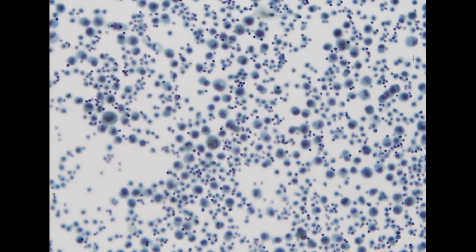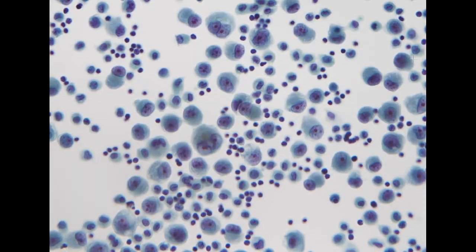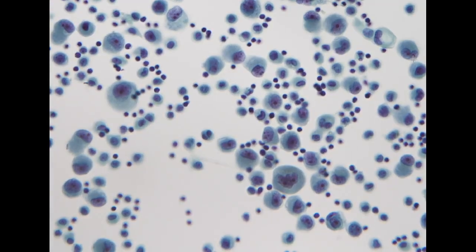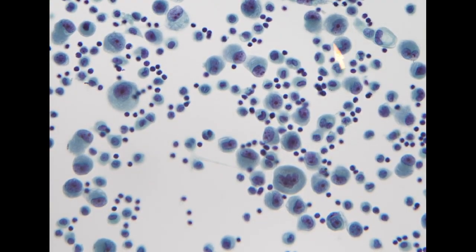So back to the pleural effusion, history of primary lung cancer. This is compatible with recurrence, but most of the cells have developed this poorly differentiated single cell appearance. So in this scenario, sometimes, as we discussed, it's quite difficult to tell if these are reactive mesothelial cells or histiocytes.